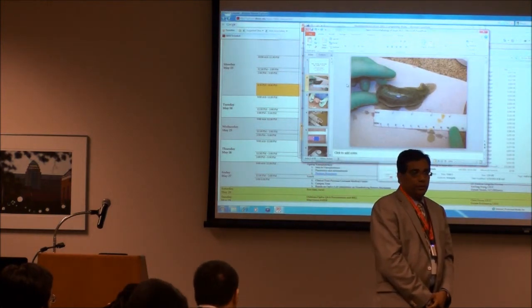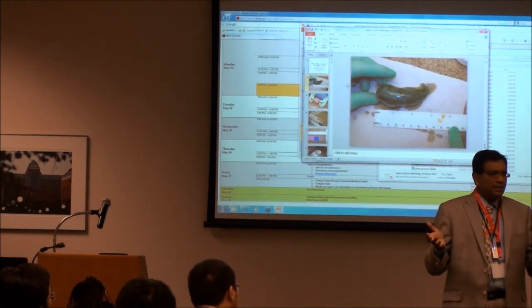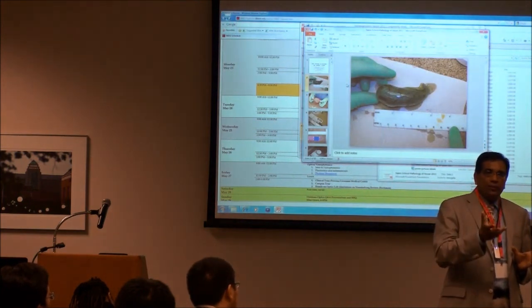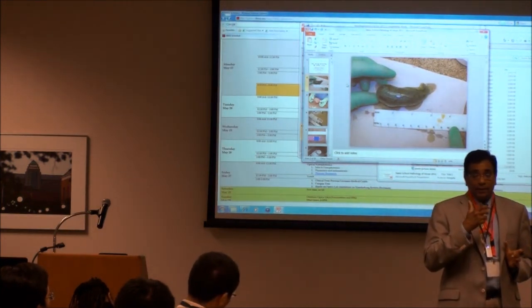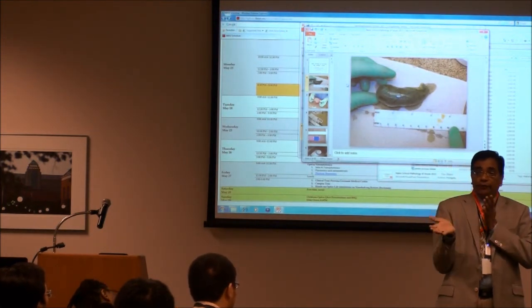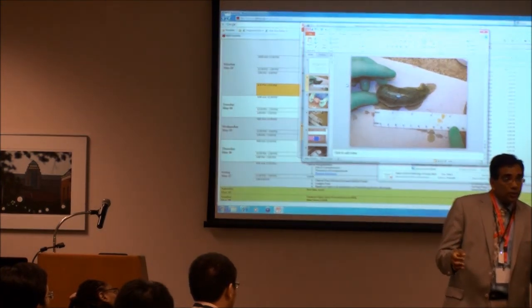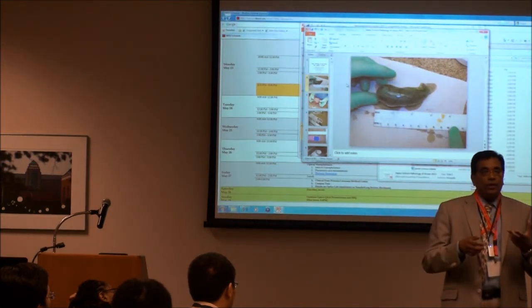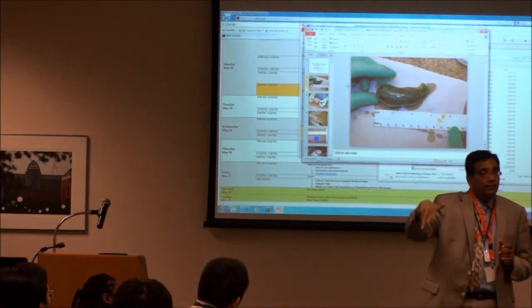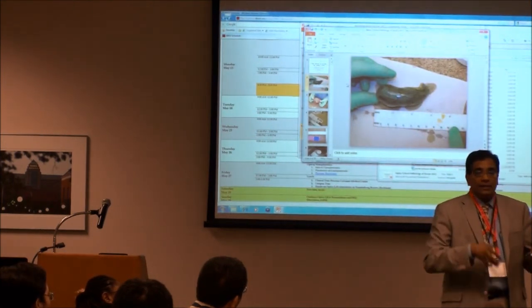So basically what we do is we do an H&E first, hematoxylin and eosin stain, and that's a routine stain. So we do the stain and look at it morphologically, what it looks like, okay? Some of them look like lymphoma or it can look like carcinoma, right? So I don't know if it's a lymphoma or a carcinoma, and it's a huge difference. Lymphoma is a good kind of diagnosis. Small cell carcinoma is a bad kind of diagnosis, right? So I would use immunohistochemical stains for a lymphocyte marker and a carcinoma marker. At that point I put both of them on and see which one comes back positive.